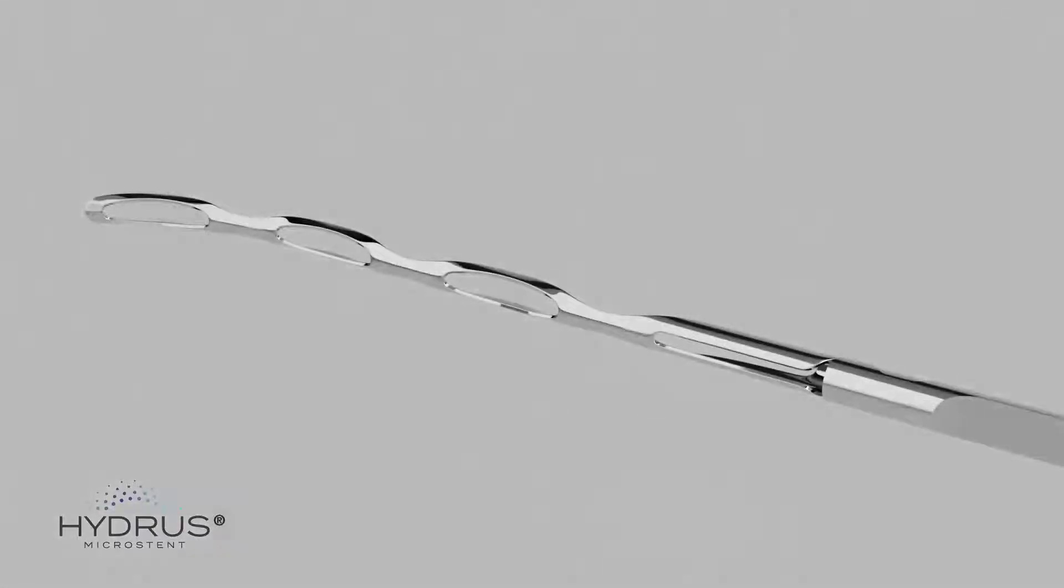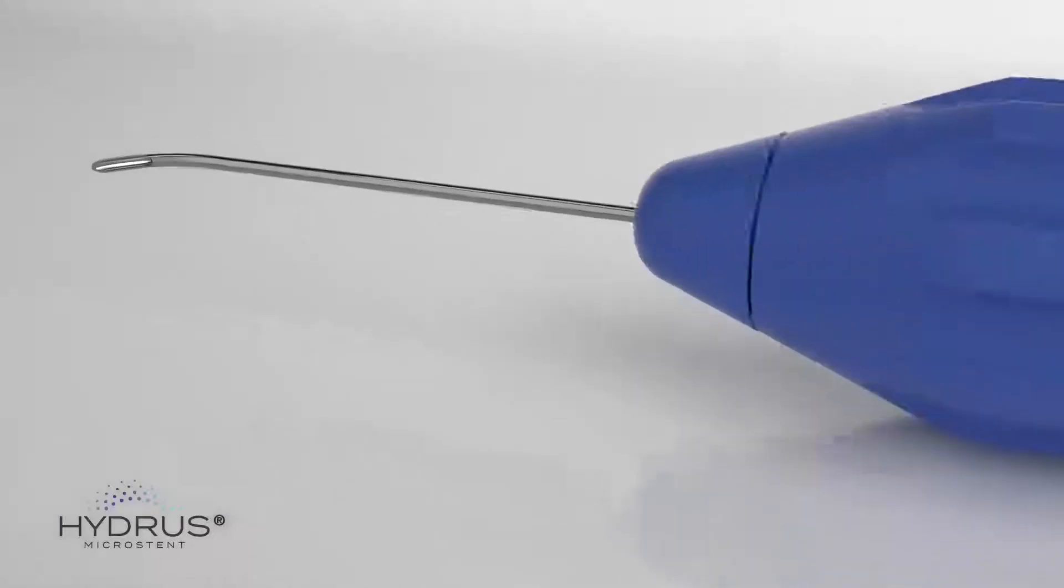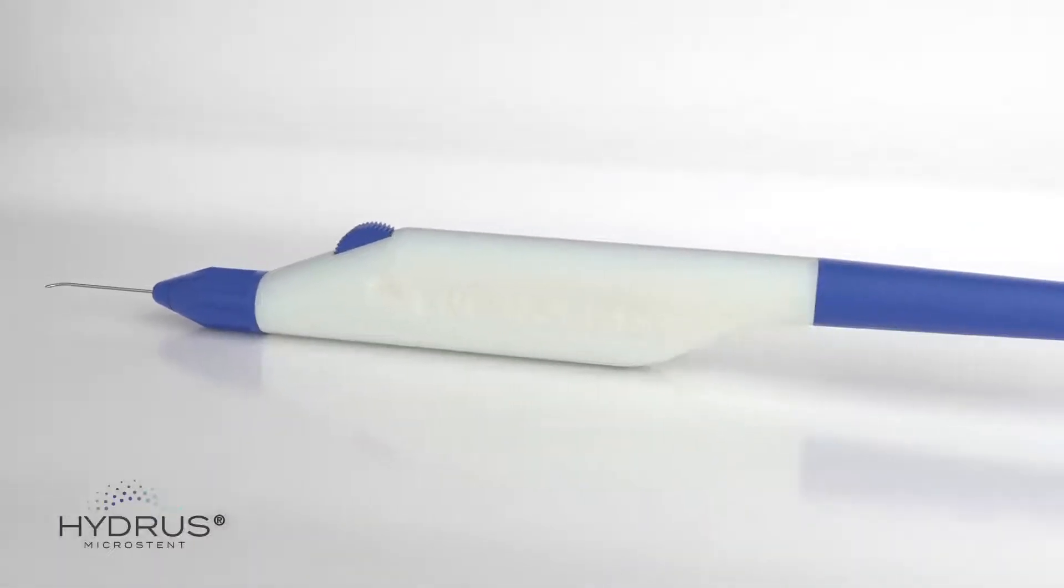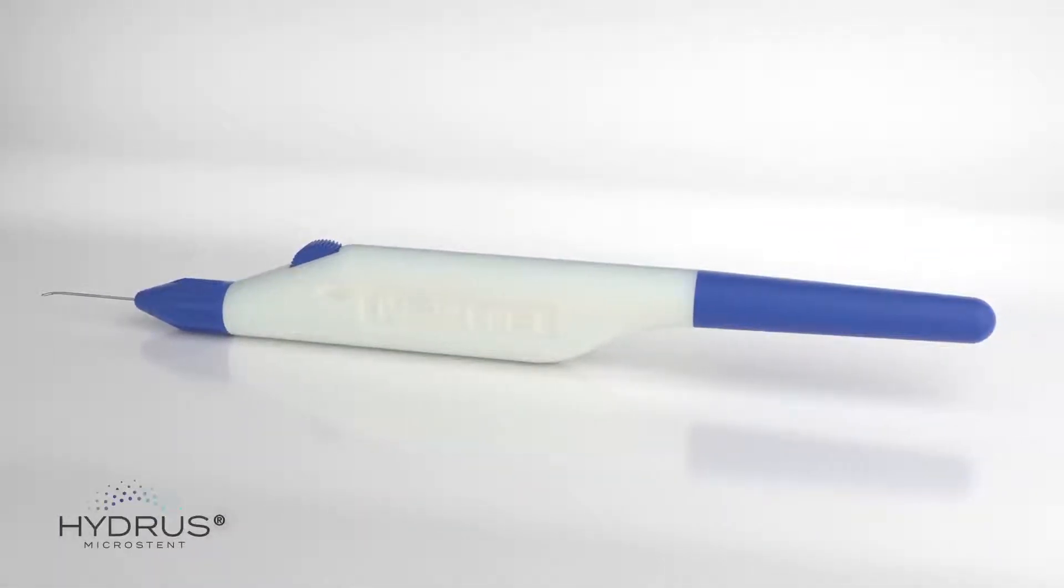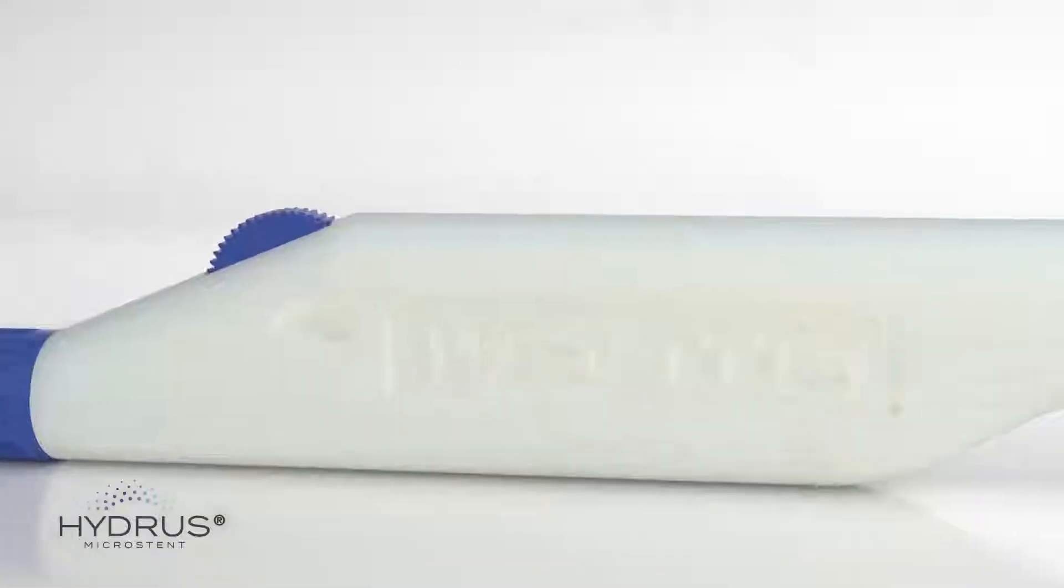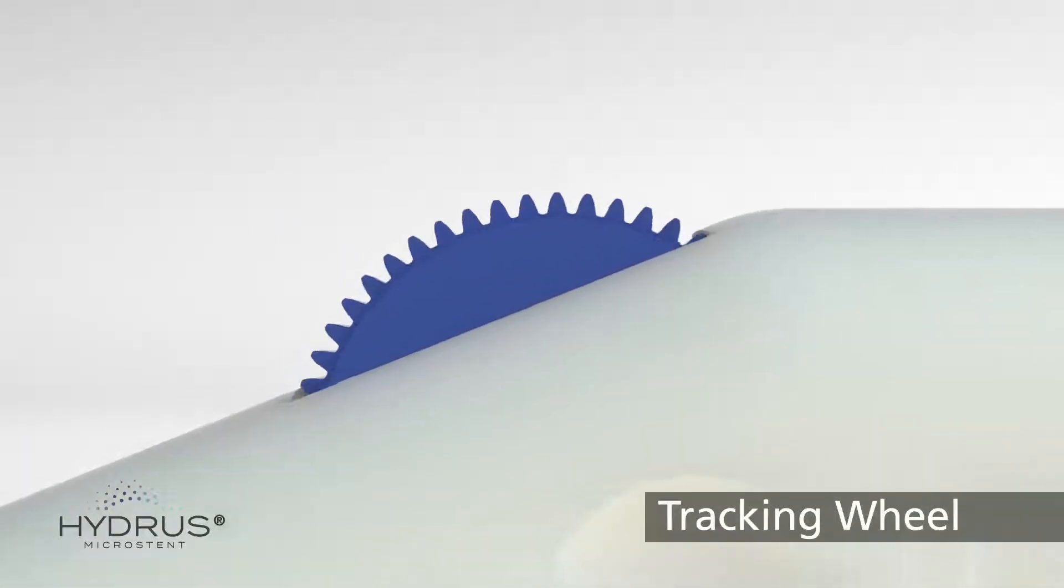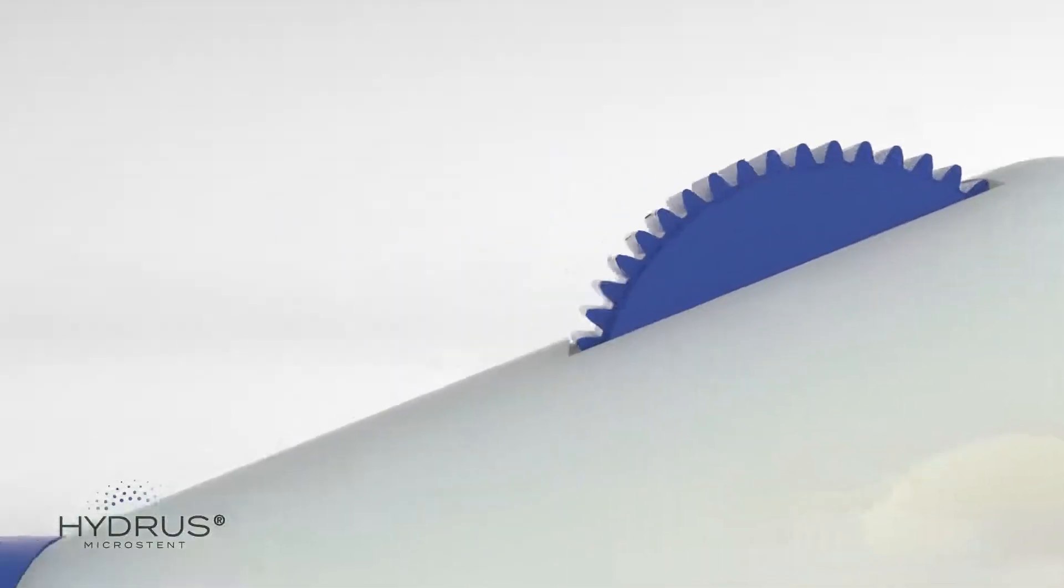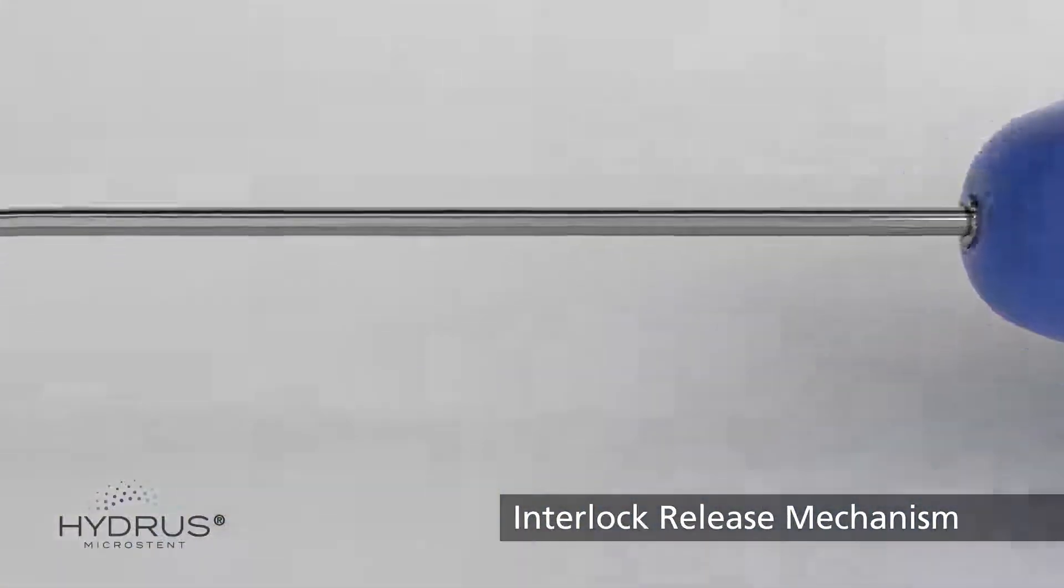The Hydrus Microstent is preloaded into the ergonomic and easy-to-use Hydrus Delivery System. The Hydrus Delivery System utilizes a tracking wheel for microstent advancement and a proprietary interlock release mechanism for precise implantation of the Hydrus Microstent into Schlem's canal.